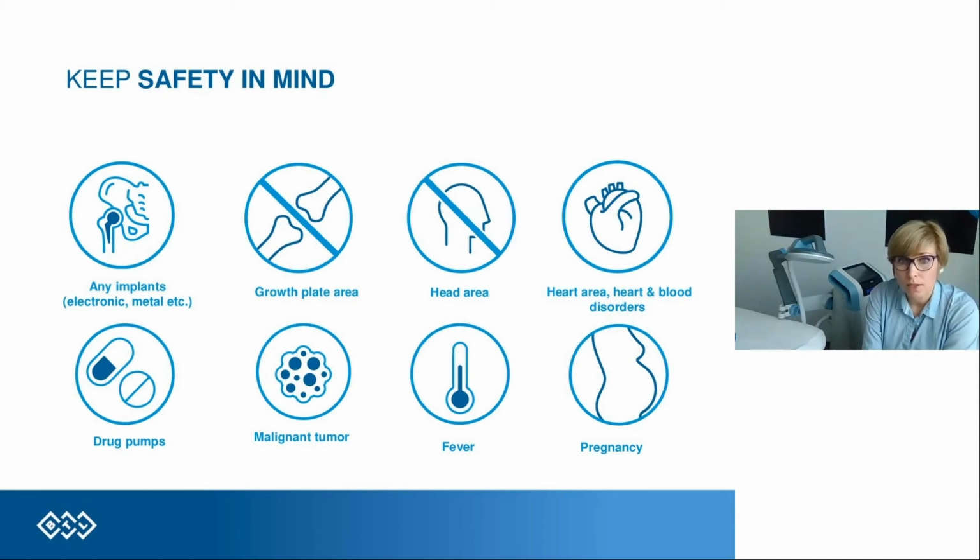So with these areas, we have to be very careful, and I'm sure you will see that the tissue reacts very quickly. Of course, drug pumps are also a contraindication, as are the usual contraindications for every physical modality.